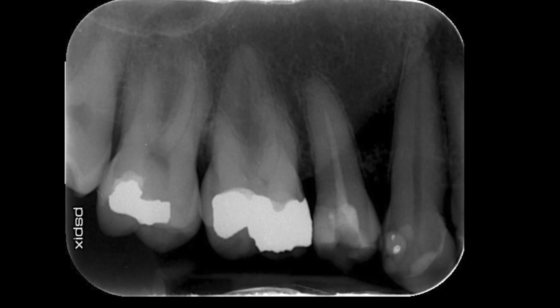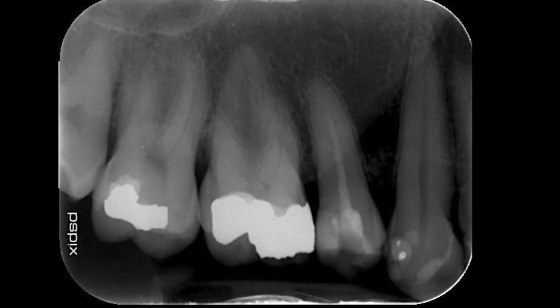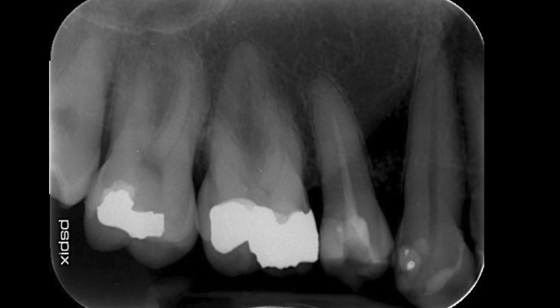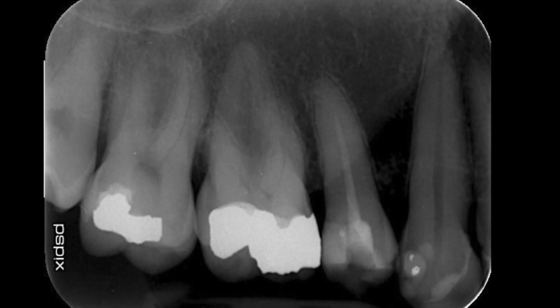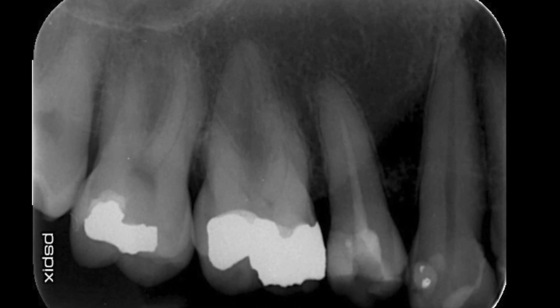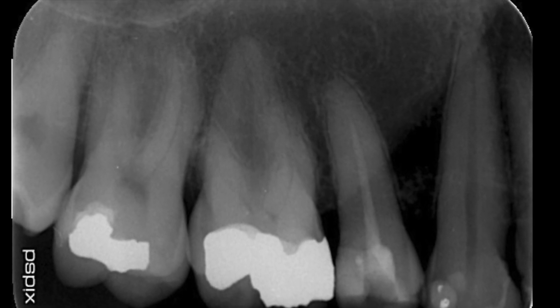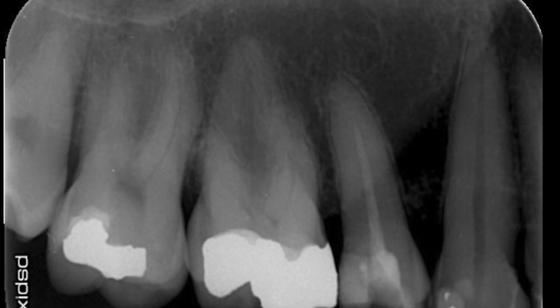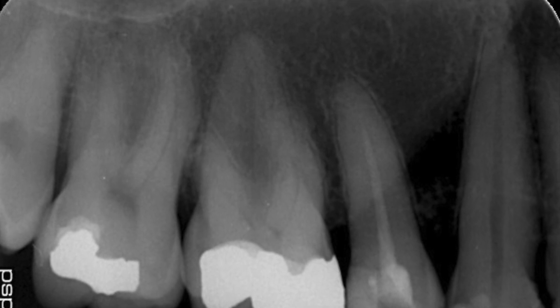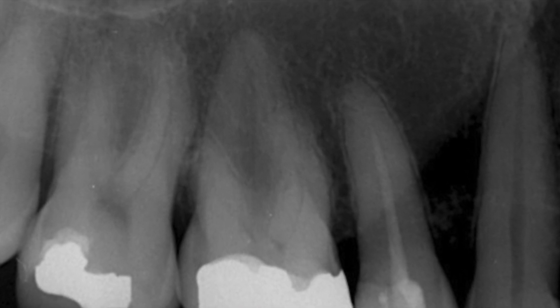Here you can see the pre-operative radiograph of the maxillary right first molar. The tooth was symptomatic. There's a moderately large amalgam restoration, the canals appear somewhat sclerosed and there's no evidence of periapical radiolucency.